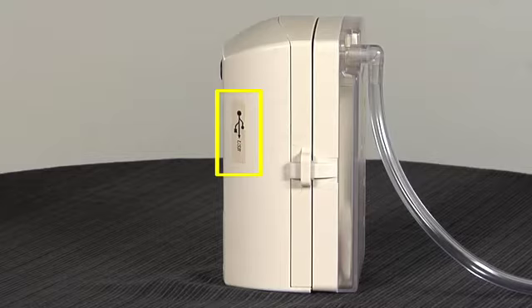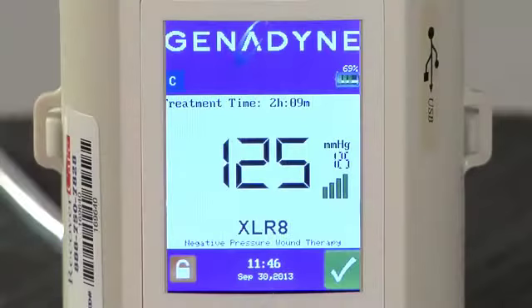The USB computer port is used to access the system software by a trained technician. The target treatment pressure reading, displayed in millimeters of mercury, is located on the main screen. To the right of the target pressure reading is the suction strength icon, which gives both a numeric and visual indication of the negative pressure being applied to the wound. The system status icon is indicated by a white check mark in a green box in the lower right-hand corner of the screen. When the unit is functioning properly, the white check mark will be displayed in this green box.